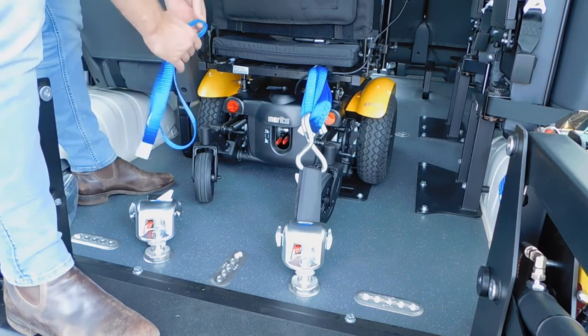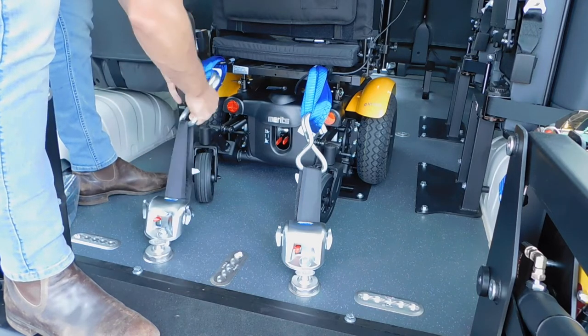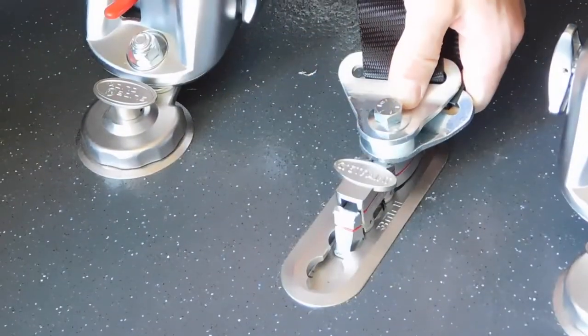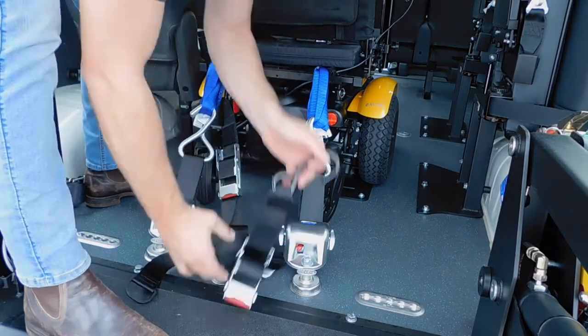If the hooks fit through the anchor point, the blue loop belts are not required. The V-belt will be locked into place when the red line marries up. Attach the hooks to the anchor points at each side of the wheelchair and tighten the ratchets.